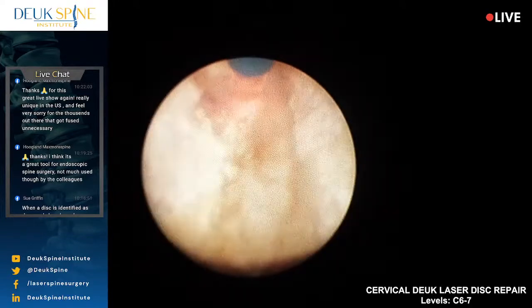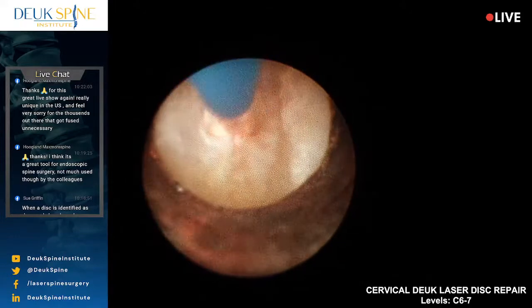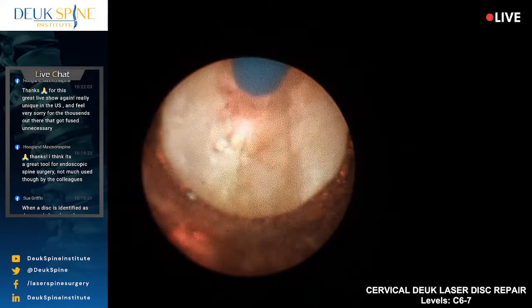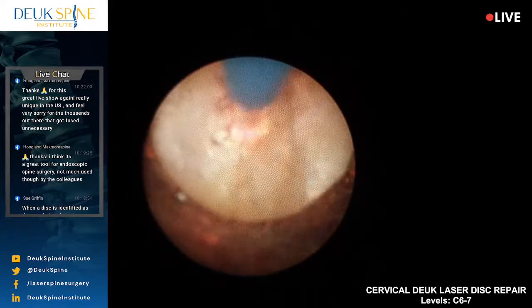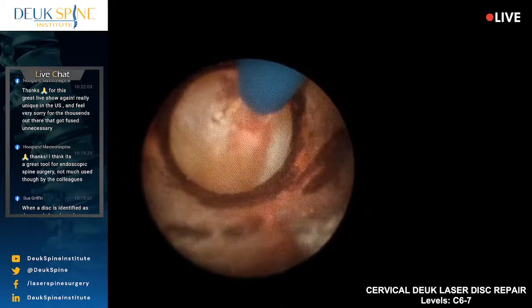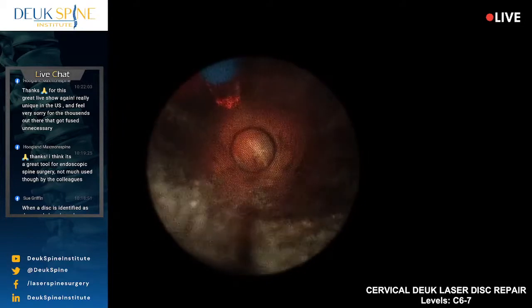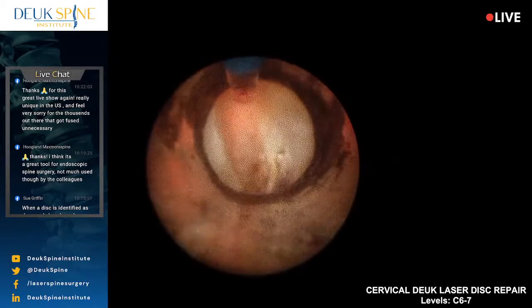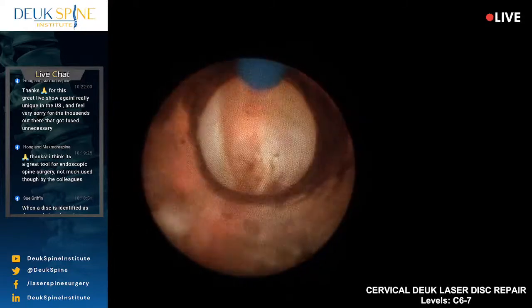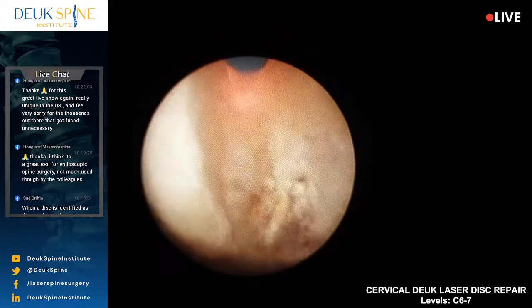That right there is the nerve root, that white thing. I've taken what I can from it. This is bone here, and I want to try to get rid of as much of the bone spur as I can. I'm going to flip and go the other way, but we're pretty close to being done. I feel like we've gotten everything we can safely off of the nerve root endoscopically. I feel pretty happy. I don't see any more herniation.